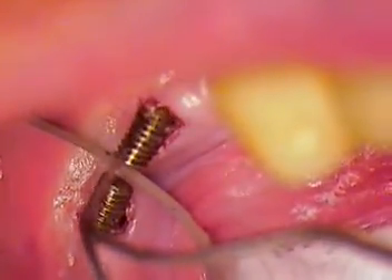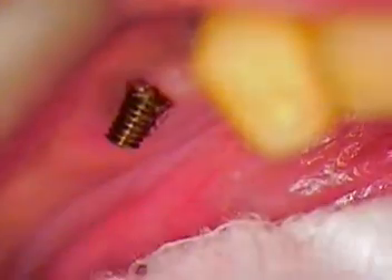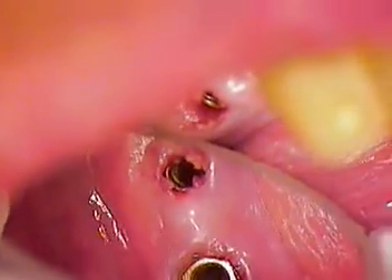That one's a real long one, so we're going to get this one out now. Let's see if we can get that suctioned up. I can grab that. Okay, very nice. So that's it — we have successfully retrieved the two broken screws. We're going to clean the rest of this up. Really pleased with the outcome. I'm going to let it sit a little bit more with this tartar and stain remover, and then I'm going to place some temporary abutments in there just overnight until we see them Thursday. So I'll show you the end of this segment in a little bit. Dr. Jerry Cuomo — catch you next time. Thank you, Kathy.